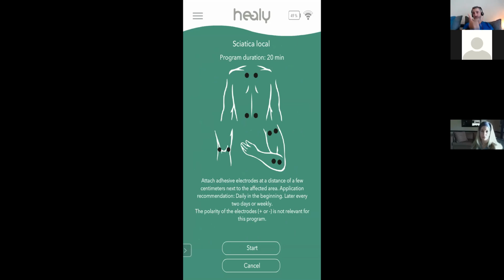But just keep in mind, if you have issues with local pain, you might try using the 3M sticky pads instead, just because they'll stay there better. Maybe someone will help us. Any EEG, any TENS compatible pads that you might find, you can try out. We might try and look for some TENS compatible pads which stick better than the ones we have. But the ones we have are nice because you can reuse them. The 3M pads, you use them once and you have to toss them.